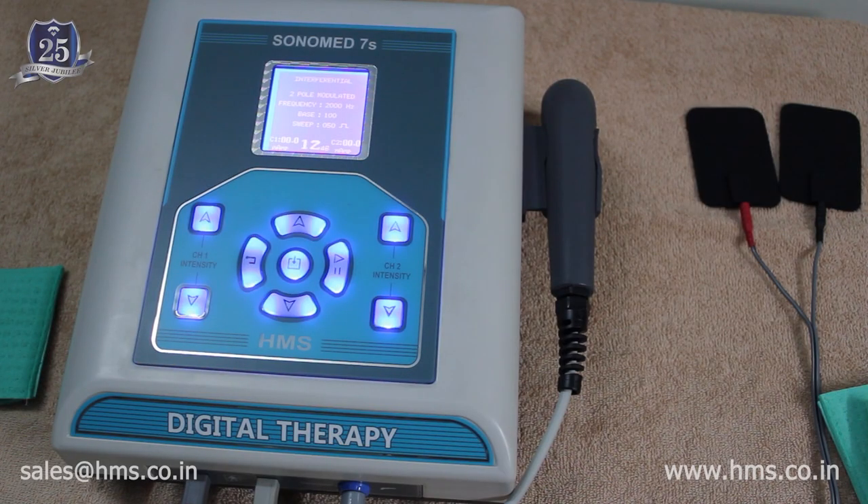These are the functionalities of the Sonomed 7s. This machine is state-of-the-art, high on technology and safety features, and is in accordance with CE and ISO standards. We hope this video was helpful. Thank you for purchasing from HMS, and we hope to provide our best service.